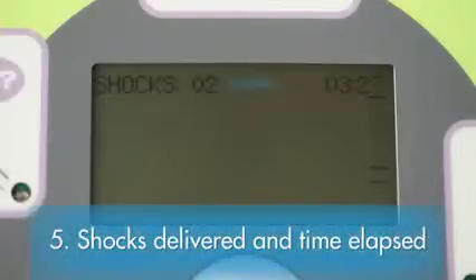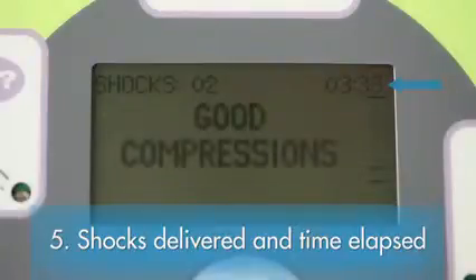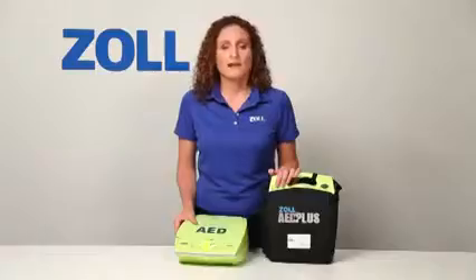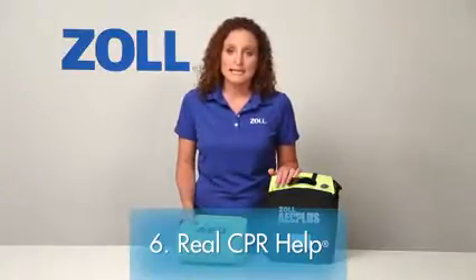The fifth element: at the top of the display screen, the AED Plus continually presents the total number of shocks delivered and the time elapsed since it was turned on. This is most important because when the ambulance arrives, the medics will want to know both of these things, which could significantly affect what they do next. Finally, the last and most important element of best possible rescuer support provided by the AED Plus is, of course, real CPR help. No other AED can see your chest compressions and guide you to a rate of at least 100 per minute and a depth of at least 2 inches, as called for by the 2010 guidelines.